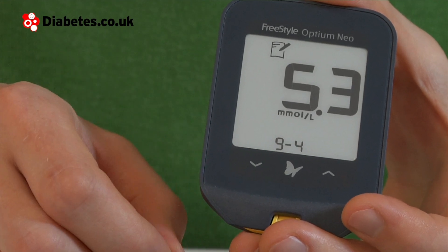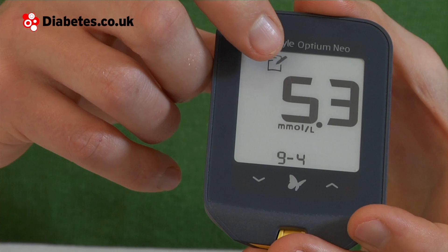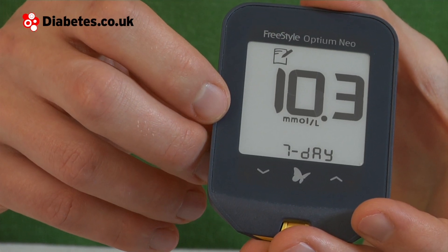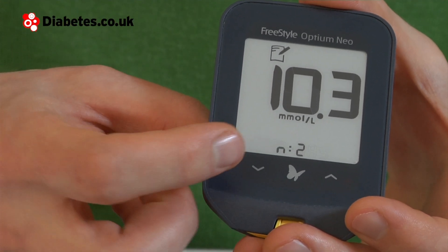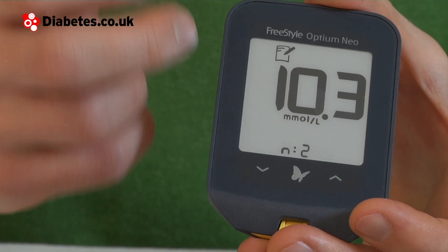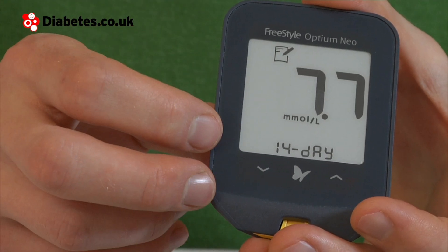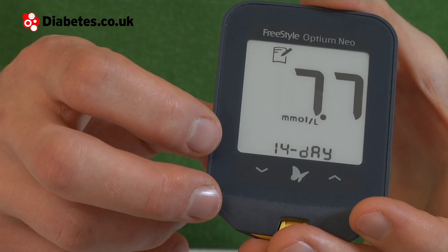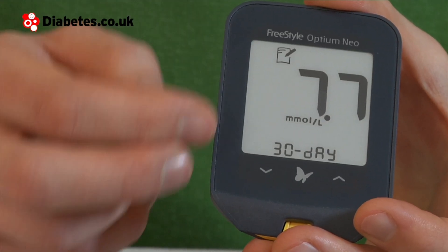Here's the rest of my results. If you want to go to your averages, you can click the log book again when you're in the log book, which will give you your averages. This is the seven day average and it also tells you where it says N2 — that means I've taken two test results in the last seven days. If I do the 14 day average, I can see I've been taking four test results in the last 14 days. And in a similar way, you can see your 30 day average.